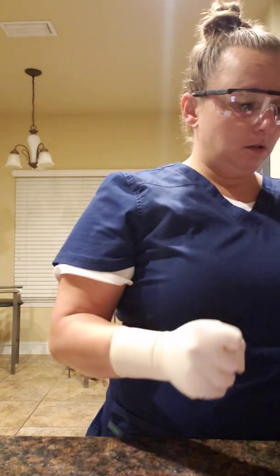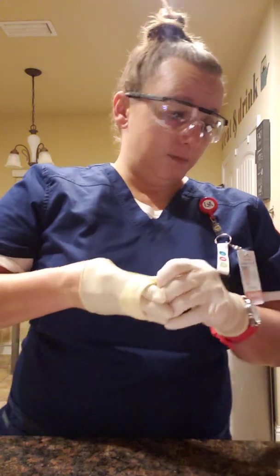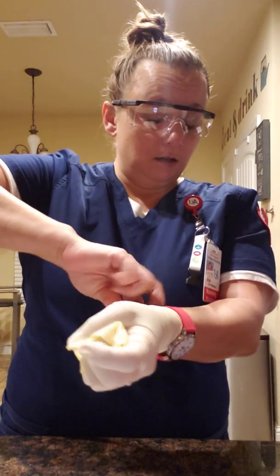Then I would lower the bed to the lowest setting. Let the side rail up. Assess the patient. Come back in 30 minutes and assess the patient again. I would perform hand hygiene before walking out.